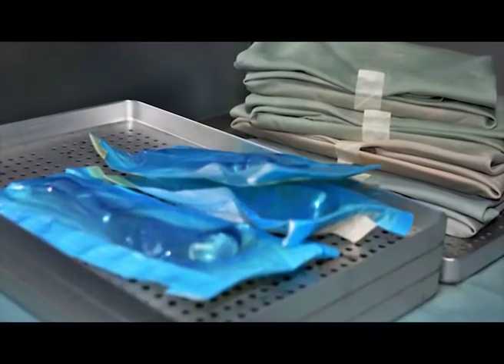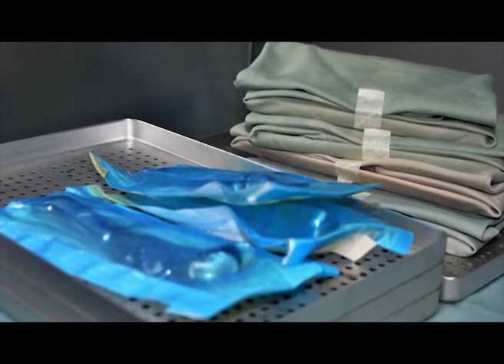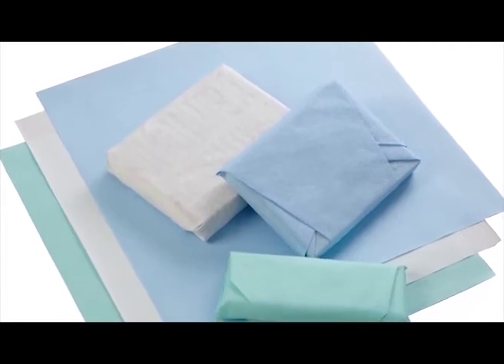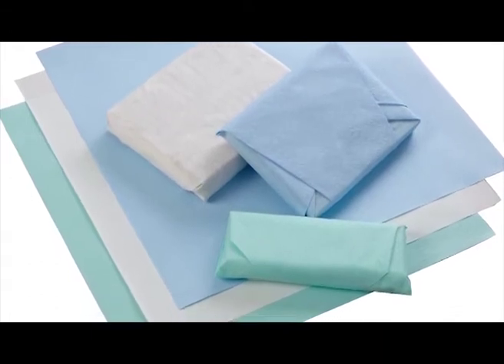It must also have high wet strength so that when the paper is wet, it can withstand the powerful changes of pressure in the autoclave without breaking. The material used for wrapping paper sheets is also very special. It must have the same characteristics as pouch paper, but must also be easy to fold and soft. Its performance with adhesive tape is also important, both in closing and opening the package.